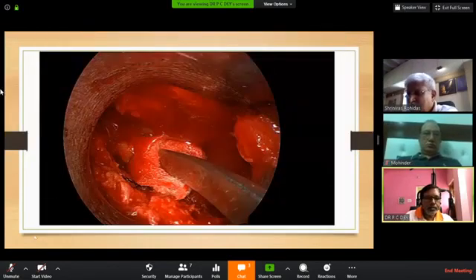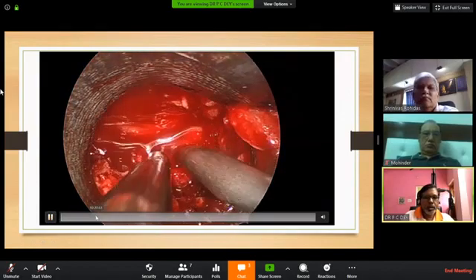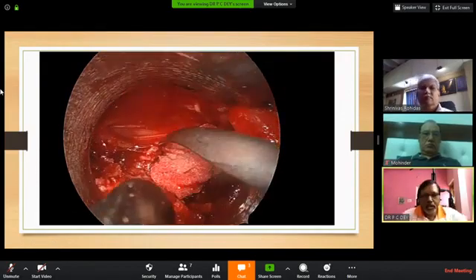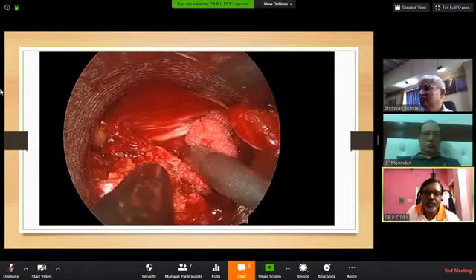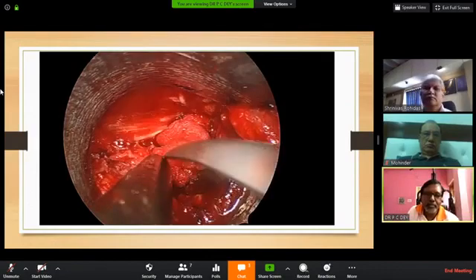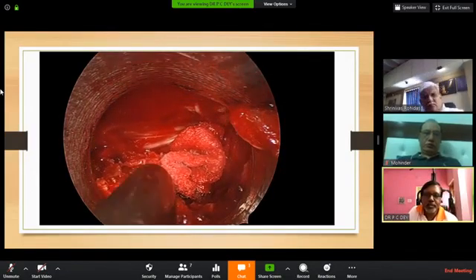So this is the surgery. I'm going. Okay. So how to control the bleeding? Dr. Mohinder, please. How to control the bleeding? Sometimes I'm facing a lot of profuse bleeding, maybe in 3-4% of cases. There is profuse bleeding and I don't know the cause.